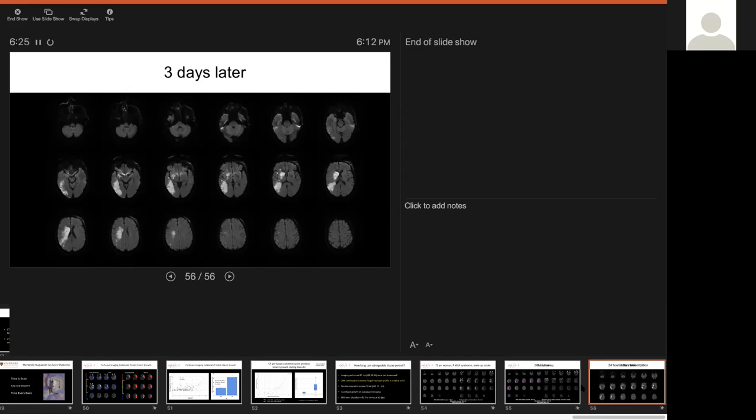What do you think about using the CTP to exclude patients within the 6-hour window? Yeah, it's a great question. And again, tomorrow I'm going to give a talk about CTP interpretation. And one of the things that you have to be careful with, not with MR, but with CTP, is that low blood flow has to be low long enough, right? We're marking things as core or estimated core based on having a very severe reduction in CBF. But you can imagine if you have a very severe reduction in CBF that lasts 10 or 20 minutes, and you relieve that, the patient's going to have a TIA. So the duration that CBF is low is very important.